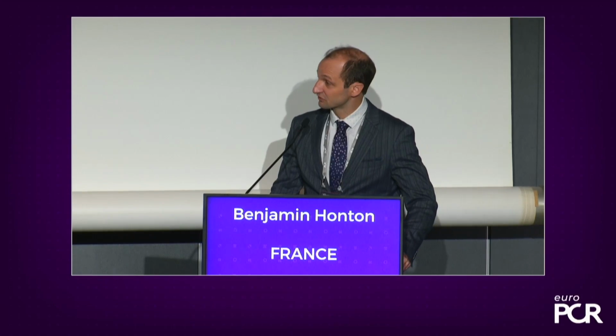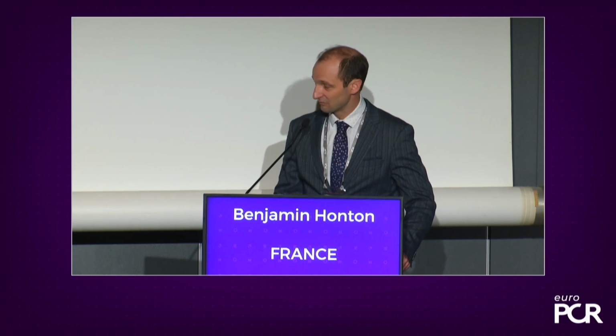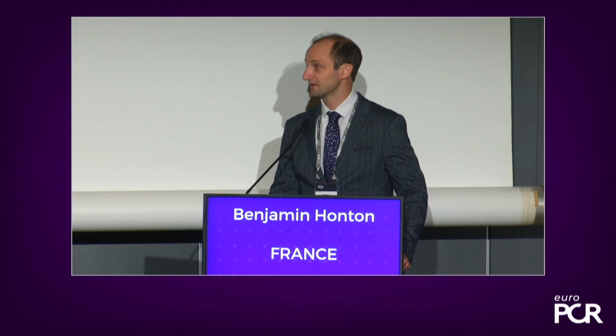I think there's a dose effect, and in the data that we've seen with eccentric and nodular calcium, and perhaps Margaret might want to comment on this, there is a clear dose effect in the densest area of calcium. The more shocks you deliver, the more modification you achieve. After this session, they have to modify a lot of indications, the company, I think. If we come back to the protocol of the CAD study, the definition of device success was a threshold of 30% residual stenosis after IVL. Maybe we can use it to be sure that the plaque is well prepared. All right, I think we can go on.